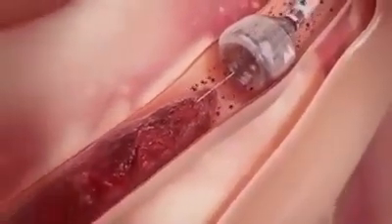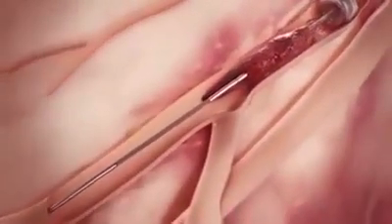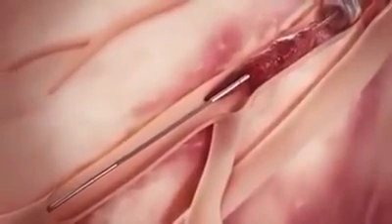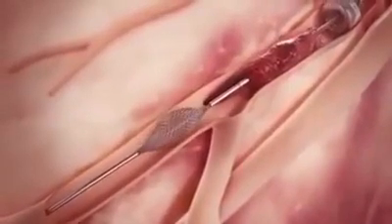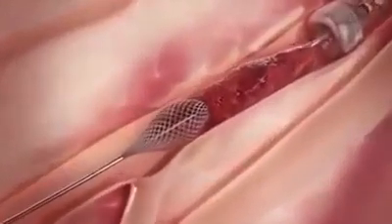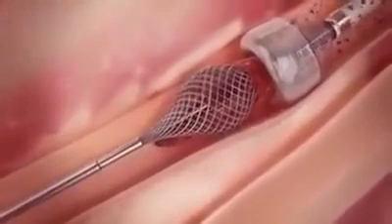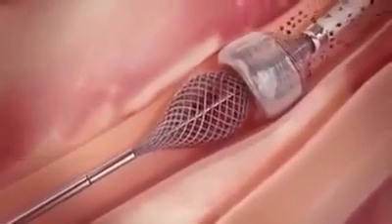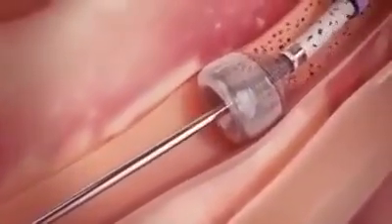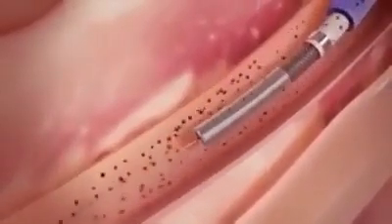Once the MegaVac arrests blood flow, the ThromboWire is inserted through the catheter, advanced through the clot, and deployed distal to the clot. While applying suction with the MegaVac, the ThromboWire is retracted to simultaneously pull the clot into the funnel mouth and through the catheter. After complete clot removal, suction is discontinued and the catheter tip is undeployed, restoring distal blood flow.